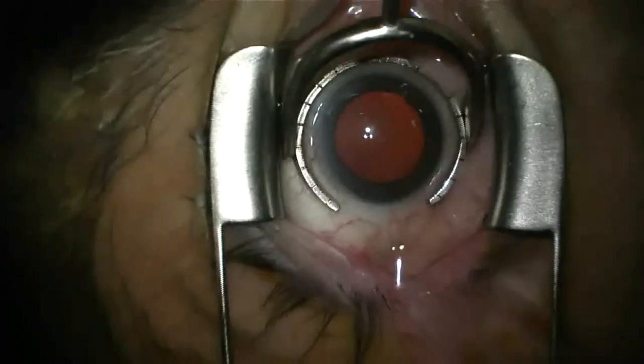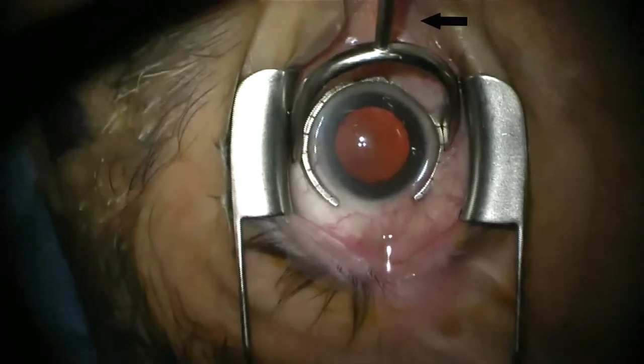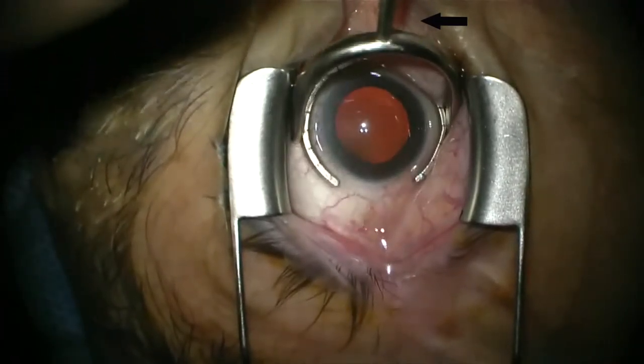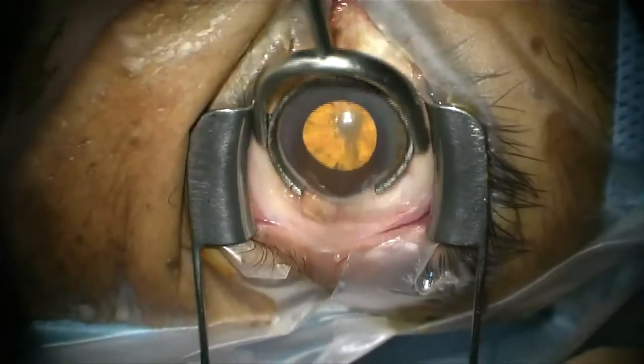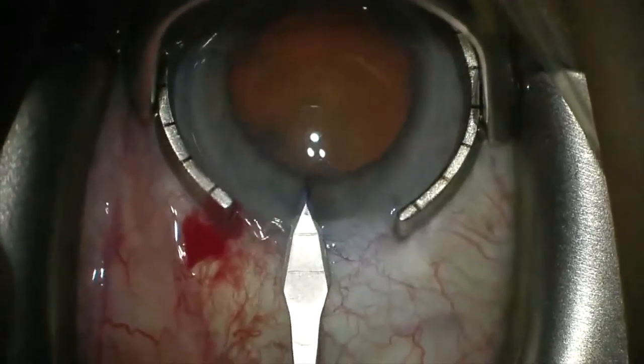In gaining proficiency with intraoperative gonioscopy, I recommend use of a fixation ring such as a Thornton ring. It provides familiarity in holding the handle of a surgical gonio lens with the non-dominant hand and facilitates nasal globe rotation to access the peripheral cornea.